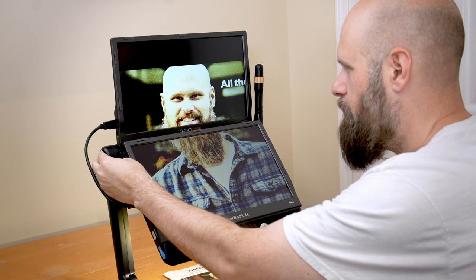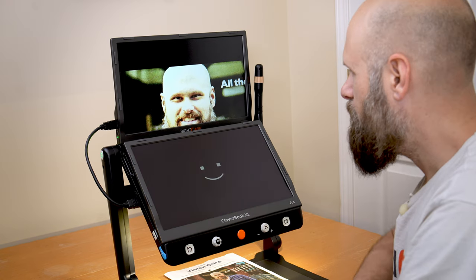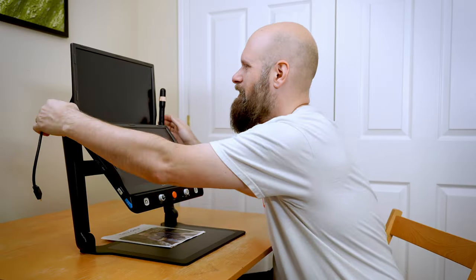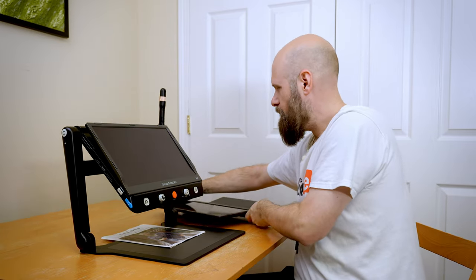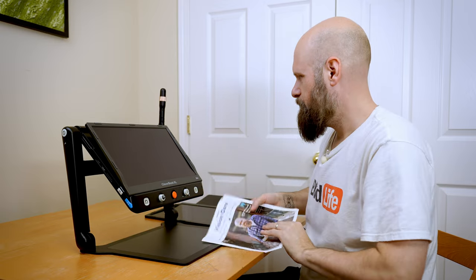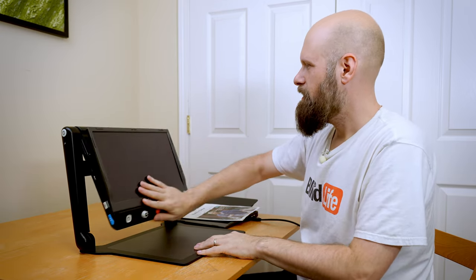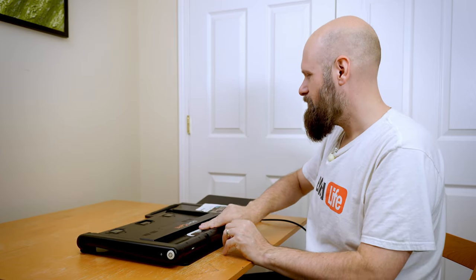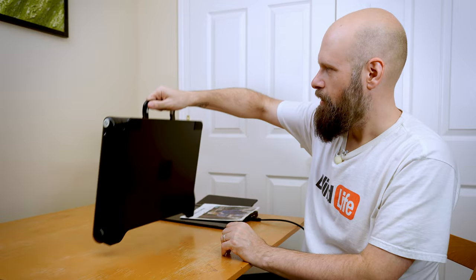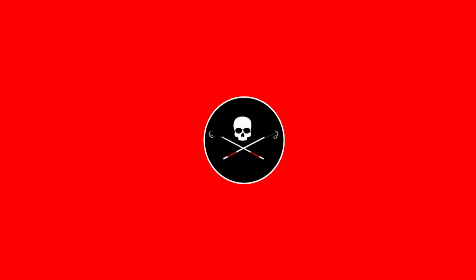To power off, long press the power button and hit the power button to turn it off. Then remove the external screen, tuck the camera, tuck the screen down, lower this section down, grab the handle, and we're ready to go.